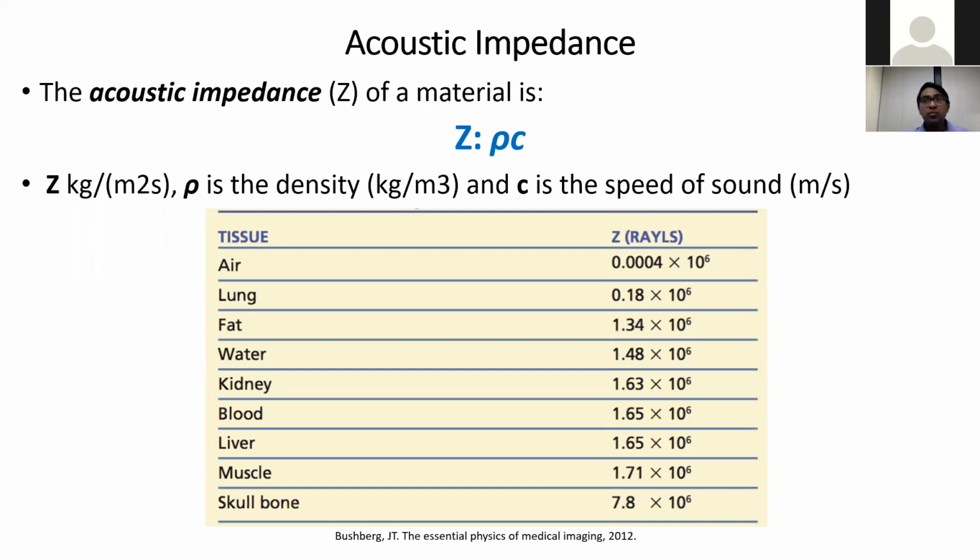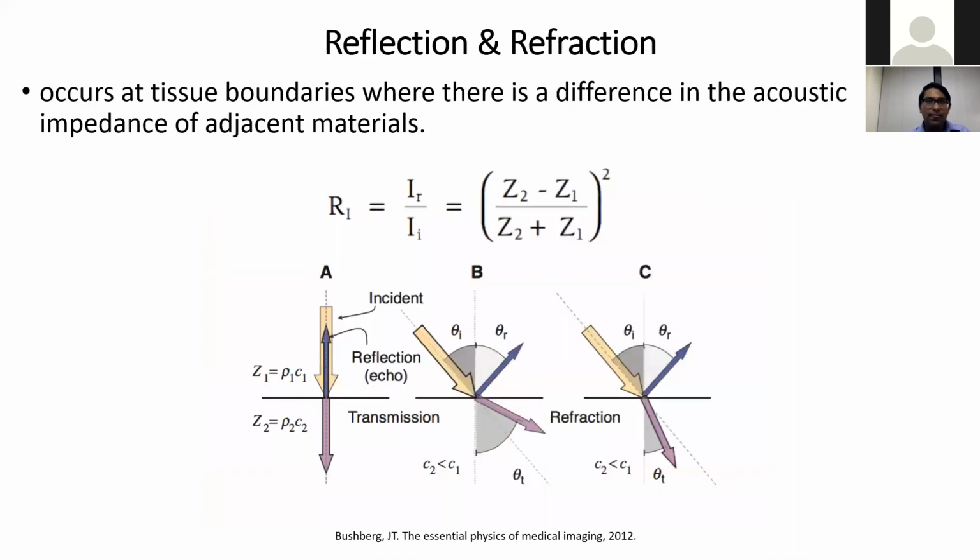If there was a medium with a homogeneous acoustic impedance, we could not generate an image from that medium. We generate an image only when we see variations in acoustic impedance. This relates back to the formula for reflection. A sound wave is only reflected back when there is a difference in the acoustic impedance.